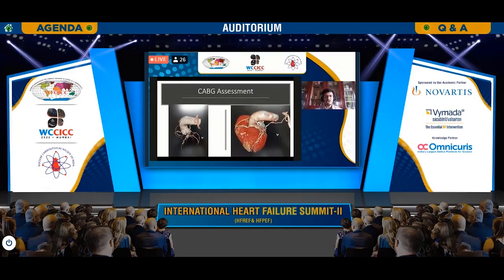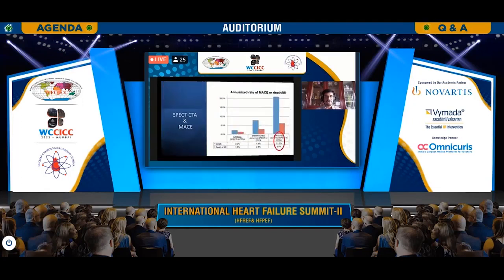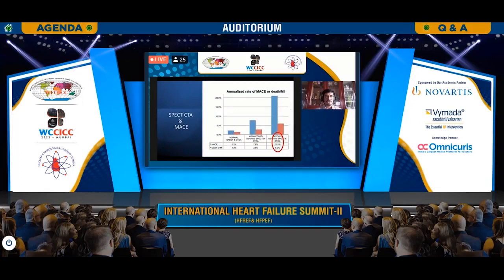In our patients post-bypass, coronary CT is a very, very valuable tool. It does this examination in 10 seconds with minimal contrast, and you get a pristine view of the graft patency, clearly ruling out graft occlusion as a cause of heart failure. With hybrid techniques, you will see that the addition of SPECT here clearly shows significant ischemia in the LAD diagonal area, which is there on stress and becomes normalized at rest, clearly showing that ischemia has to be taken care of in this patient to avoid the progression of heart failure.